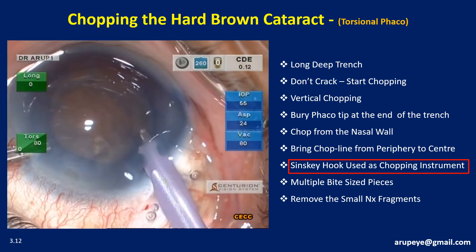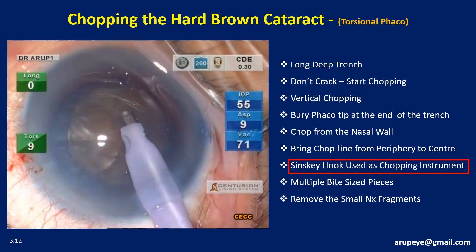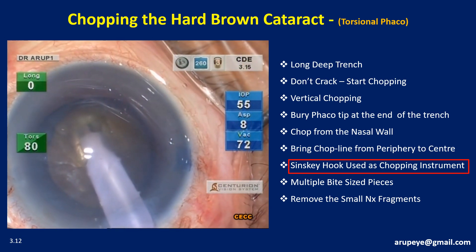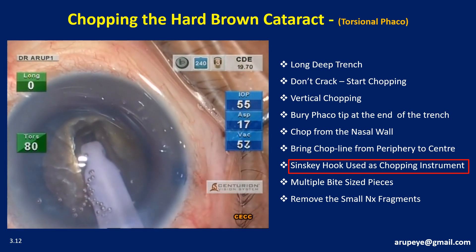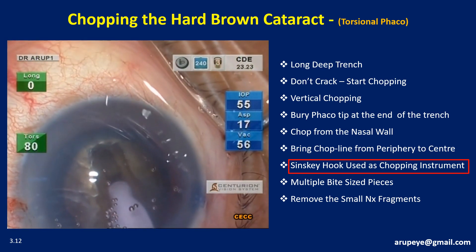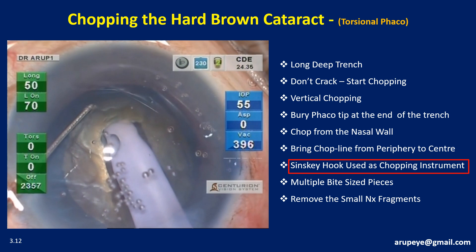Before proceeding with trenching or chopping, it is useful to clean up the superficial lens matter as well as the OVD in front of the nucleus. A few OVDs like Viscoat are thermogenic and can result in wound burns. In this case, the central groove is sculpted using 80% torsional phaco power and a balanced tip. The aspiration flow rate may need to be stepped up to facilitate rapid clearing of the lens milk generated during sculpting. It is useful to shave the side walls of the groove for enhanced access of the phaco tip-sleeve combo to the floor of the groove, enabling the phaco tip to reach the trench floor for further deepening. Once the trenching is deep enough, it is time to chop.